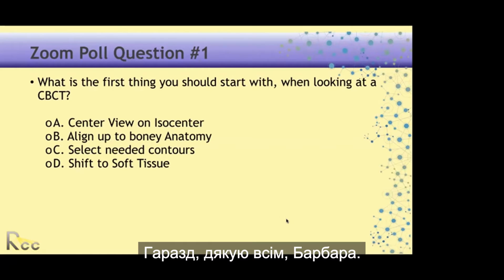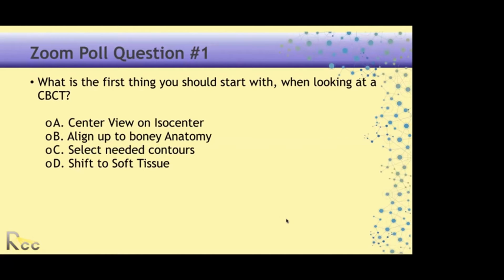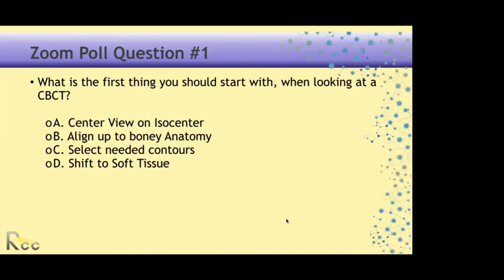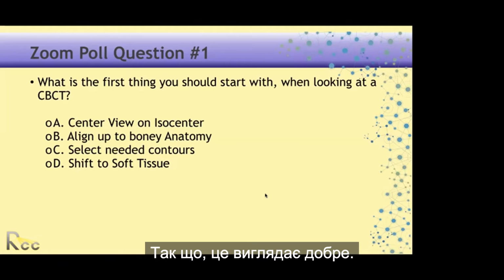All right, thank you, everyone. So it looks like we kind of had it between A and B. Yeah. So this looks good.